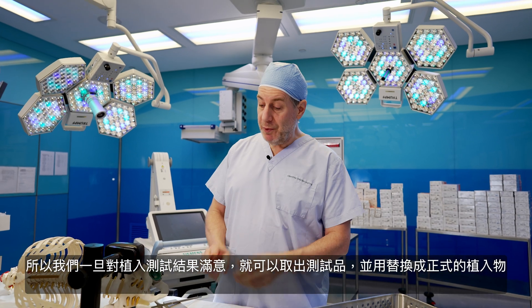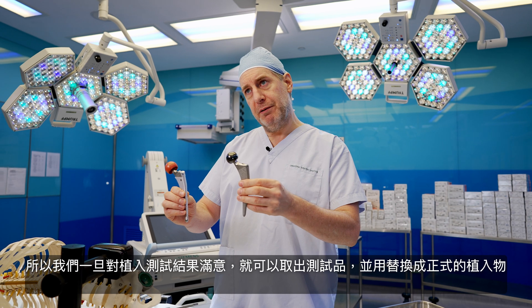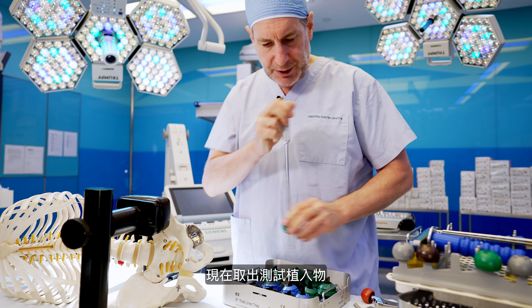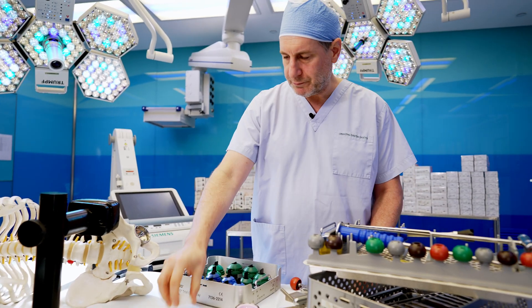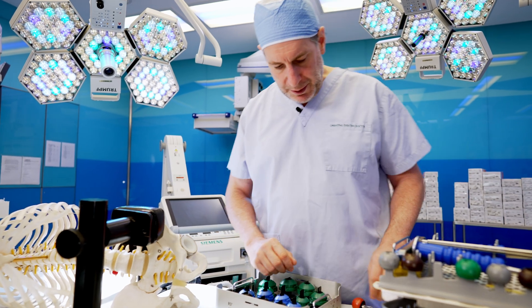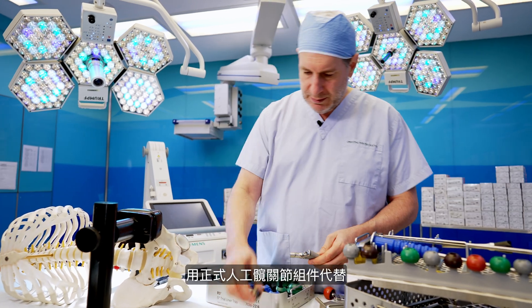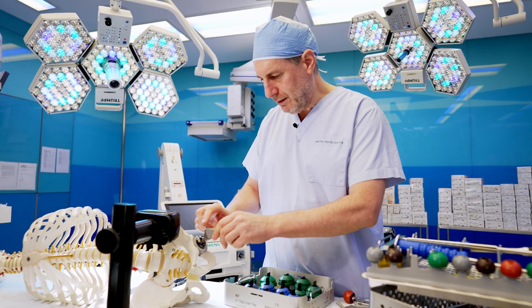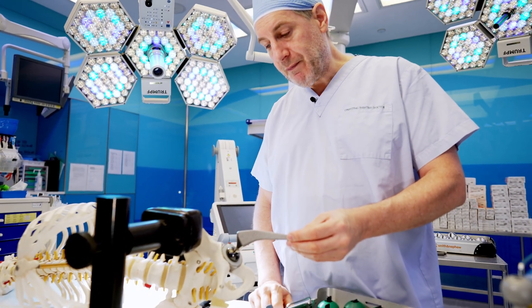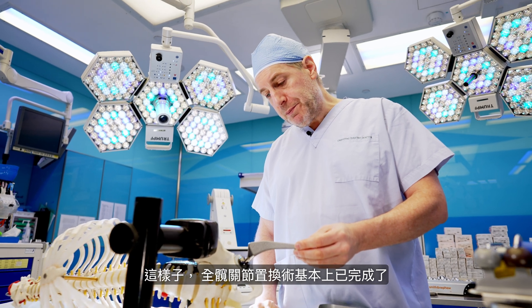Once we're happy with the trial implants, we can take out the trial implants and replace them with the definitive implant. We remove the trial component, place the definitive component, recheck the range of motion and stability, and the total hip replacement is in place.